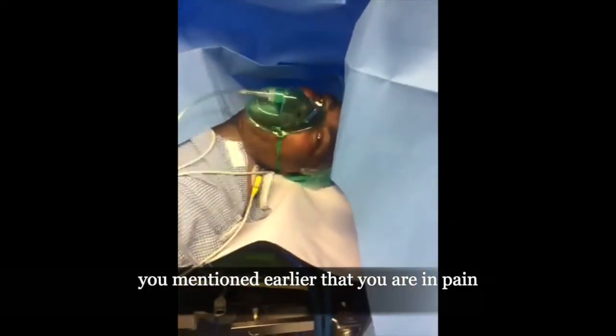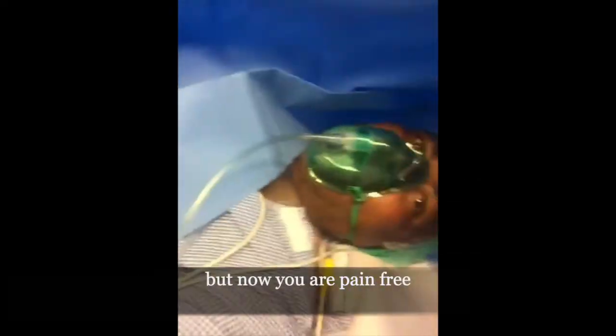There are people here. You have said that there is pain. Yes. There is no pain — it's already done.